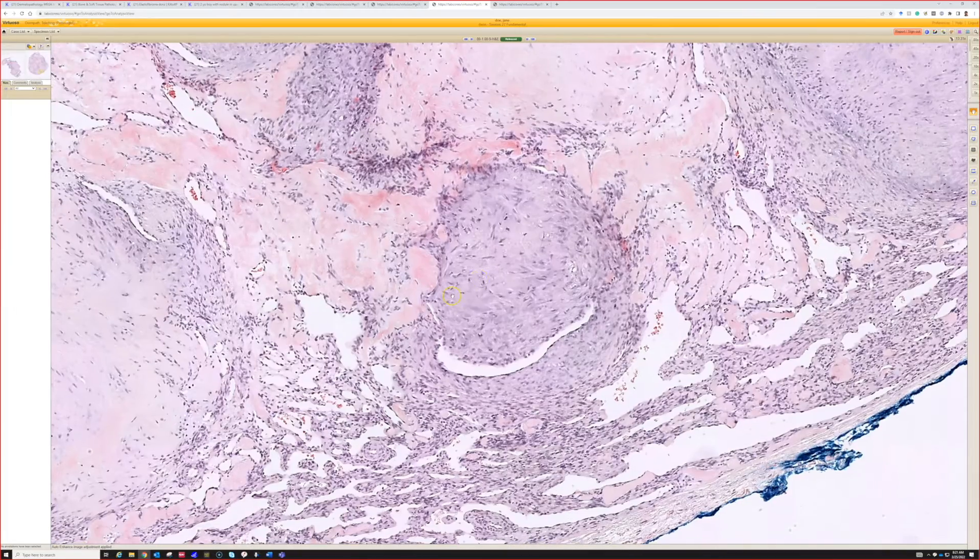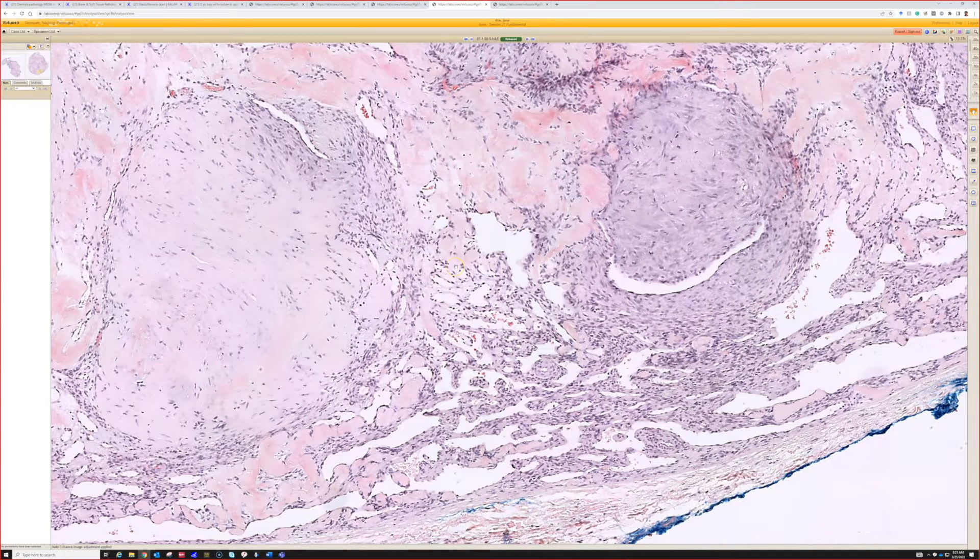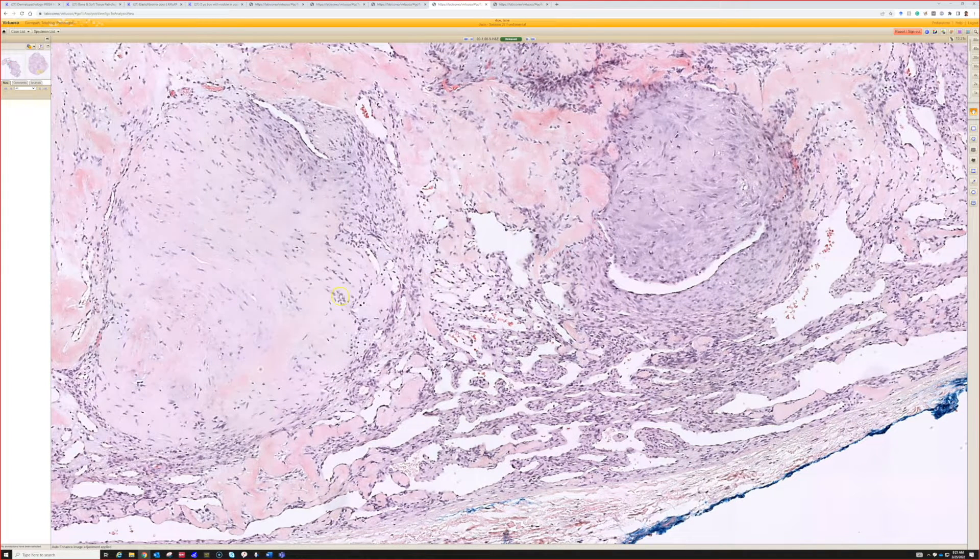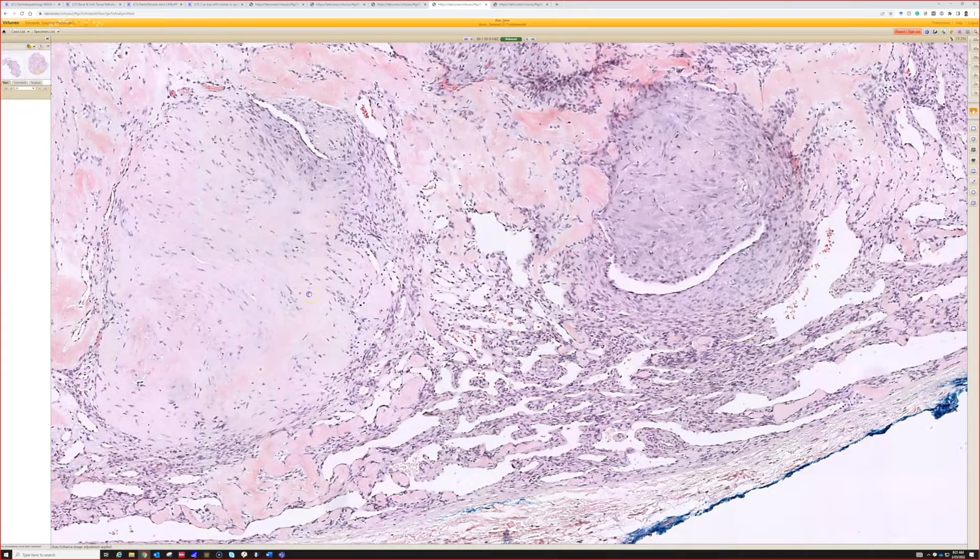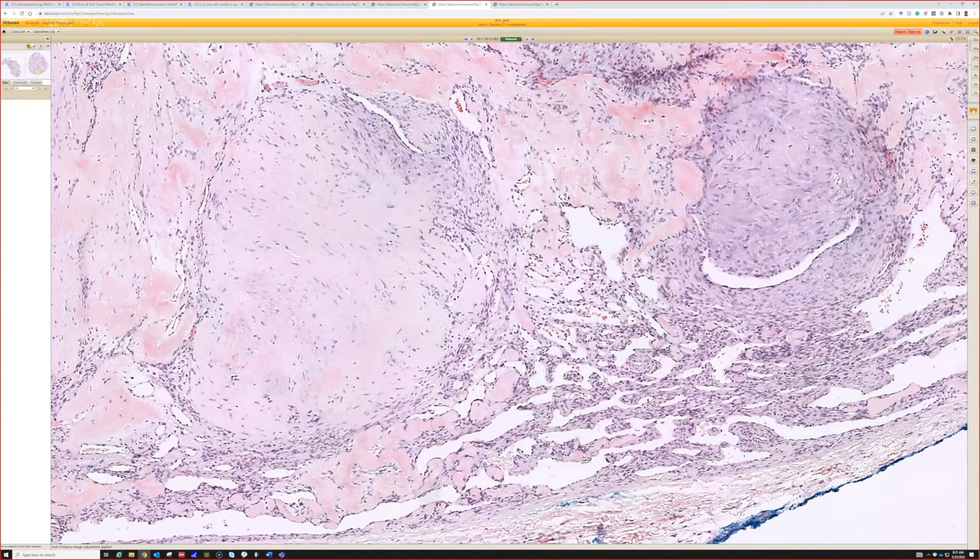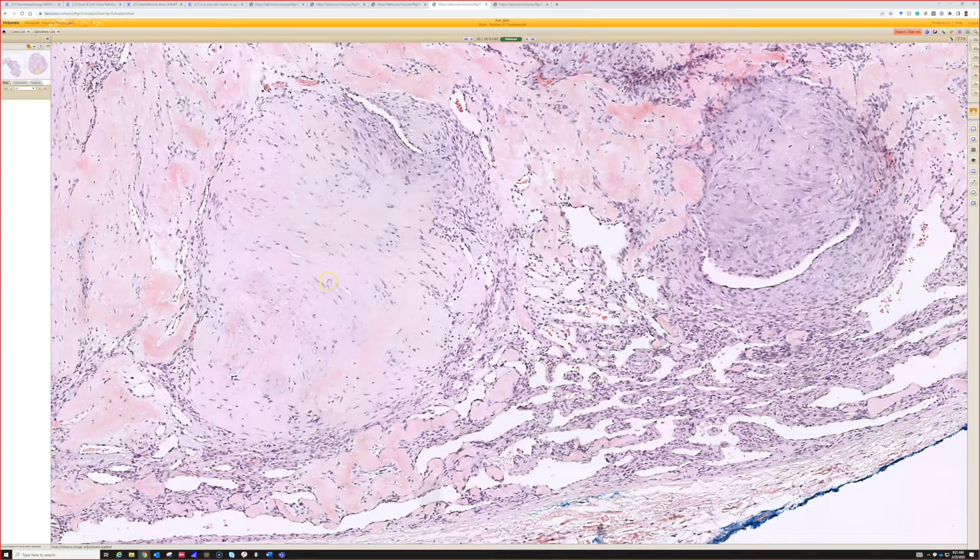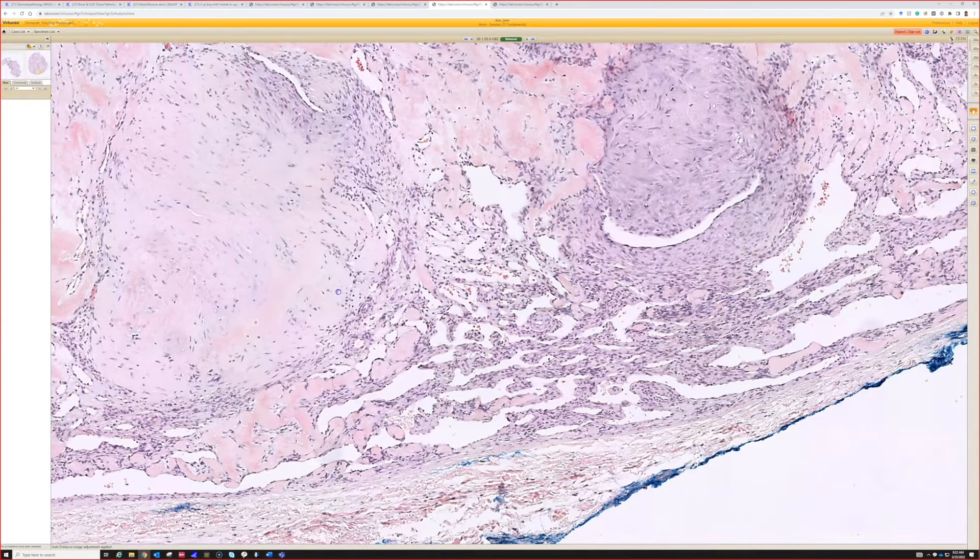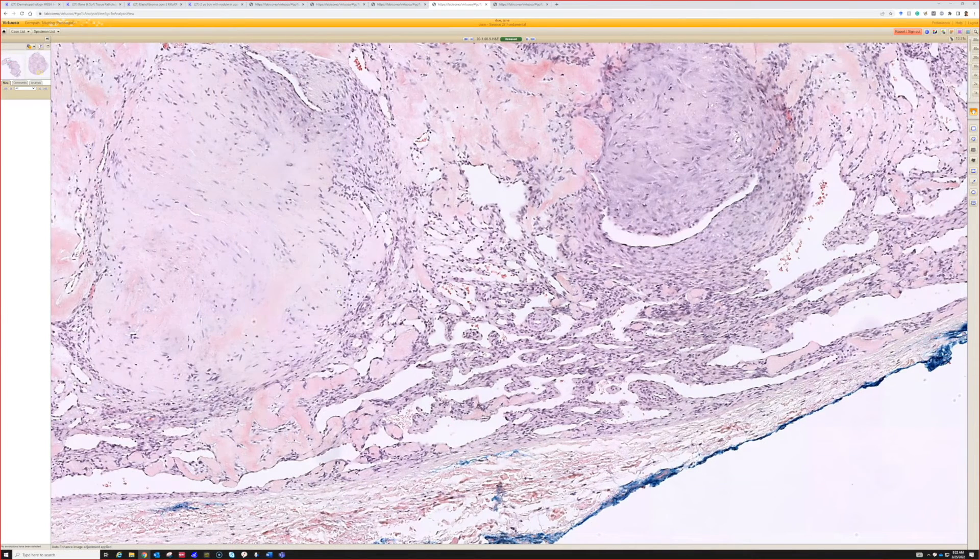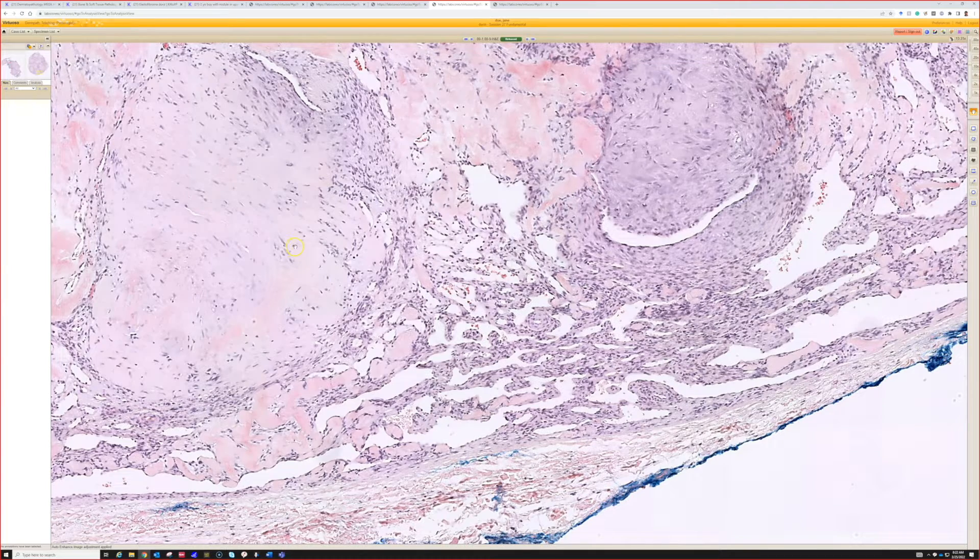These cells are myofibroblastic - they stain with actin but they're desmin negative usually. But as I told you before, myofibroblast and fibroblast to me probably exist on a spectrum. At least the lesions that are fibroblastic or myofibroblastic seem to all have a lot of overlap and similarity.